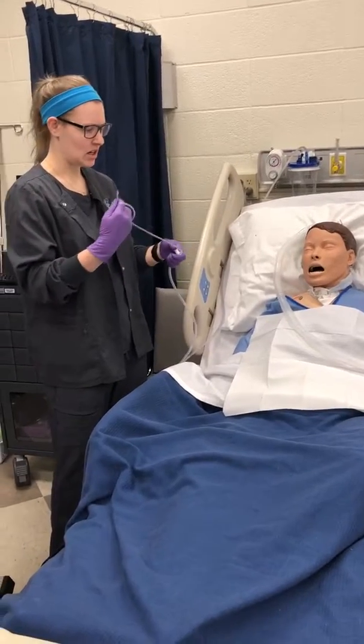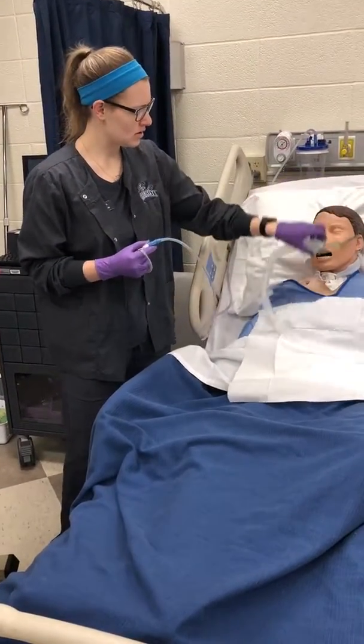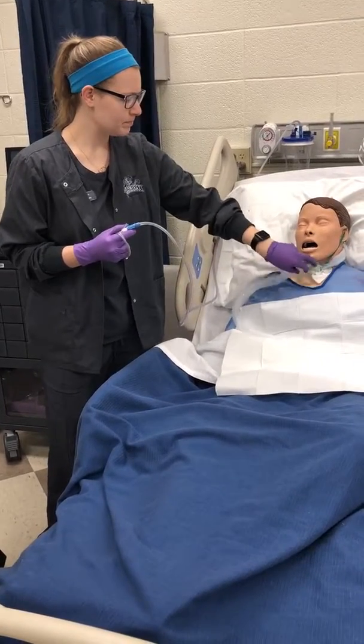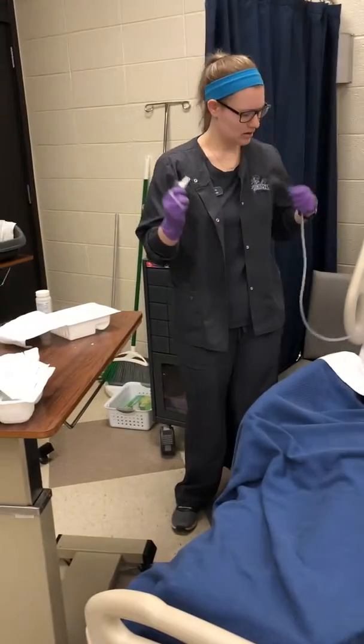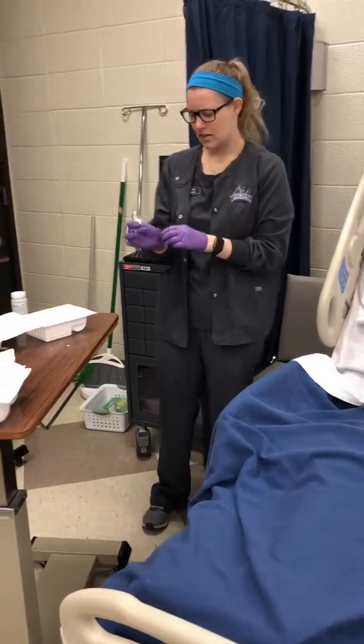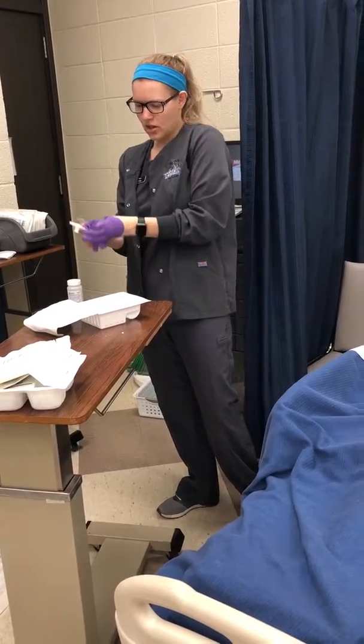So when I'm done and they're suctioned, you can go ahead and put the oxygen back on them, and then disconnect this and dispose of this in the trash can.